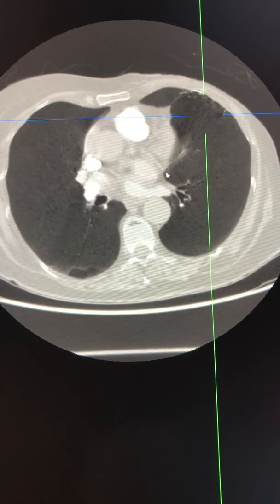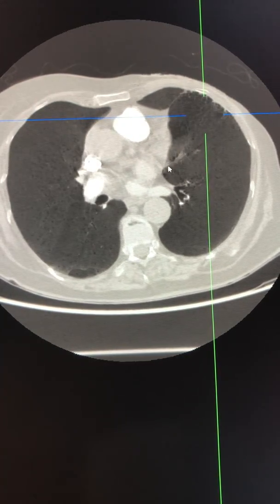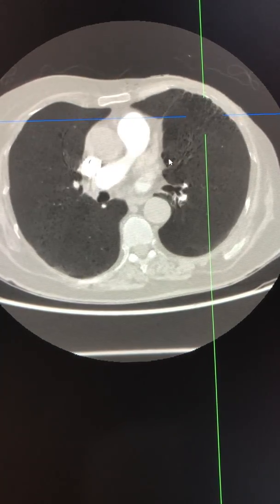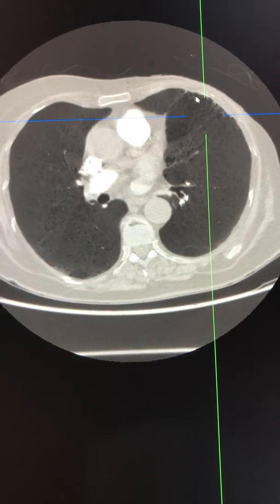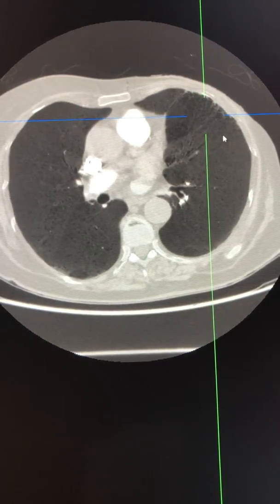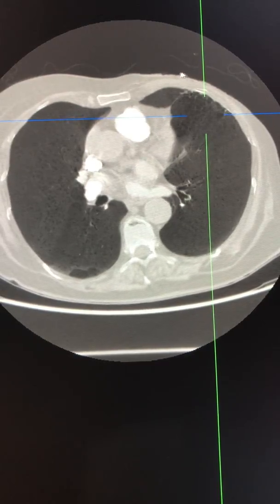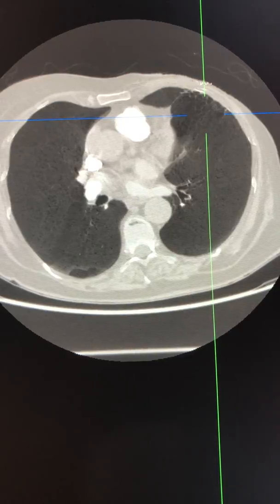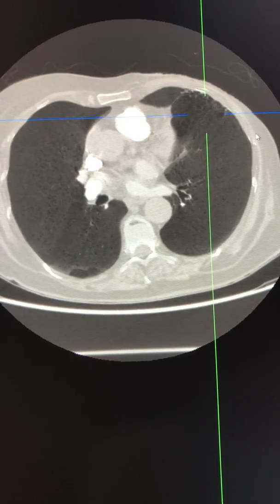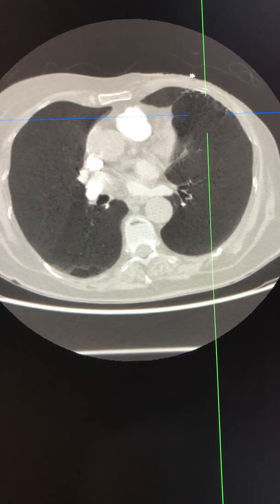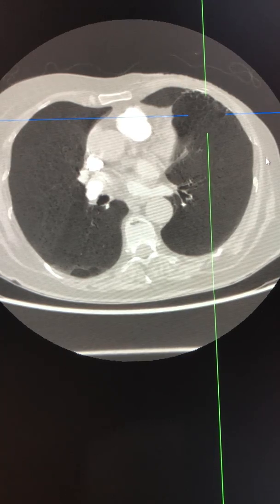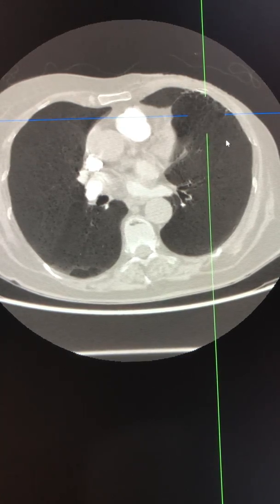If you look closely, these are accompanied by areas of scarring, and also a rather thin chest wall and skin irregularity with absence of the breast contour.